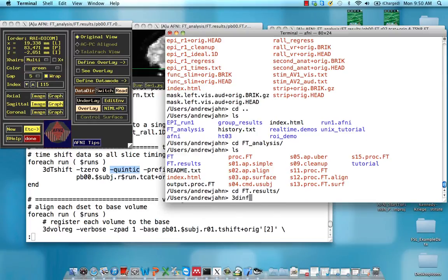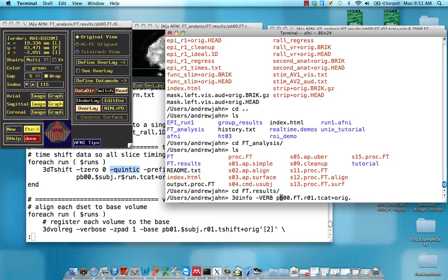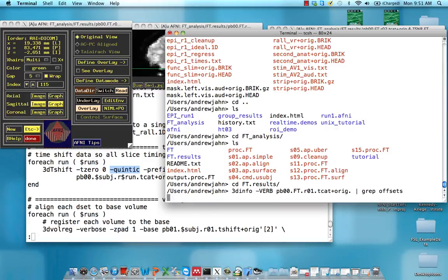I'm going to use this command called 3dinfo to get some more information about this tcat dataset. I'm going to give it an option, VERB, all uppercase, and I'm only going to grab the information that I want. So grep offsets.